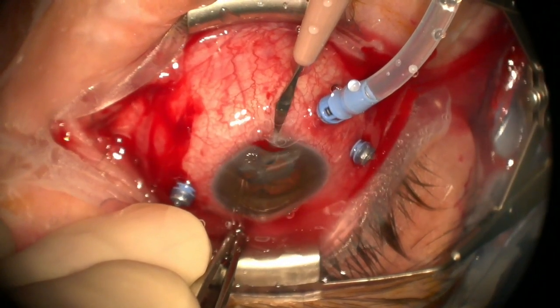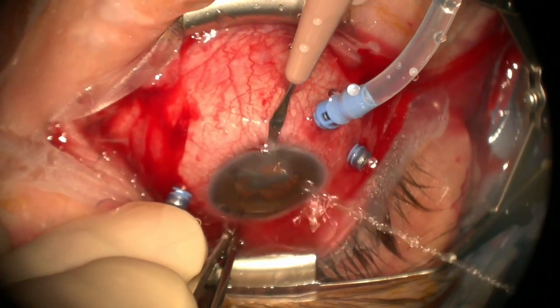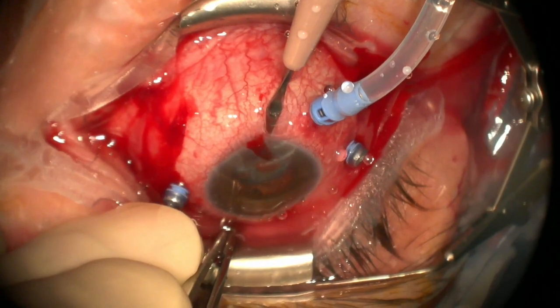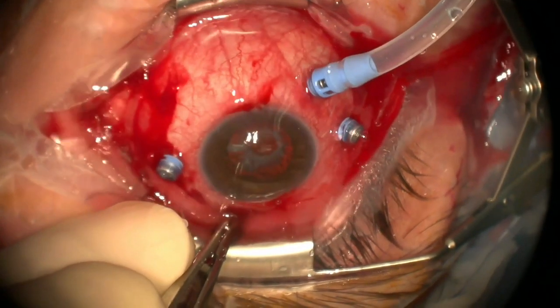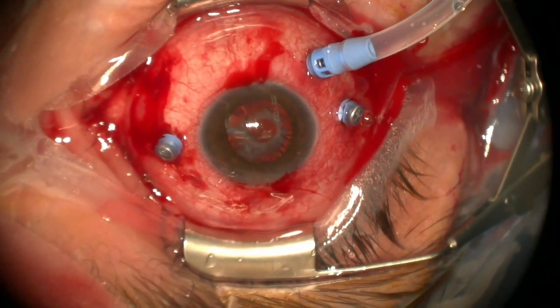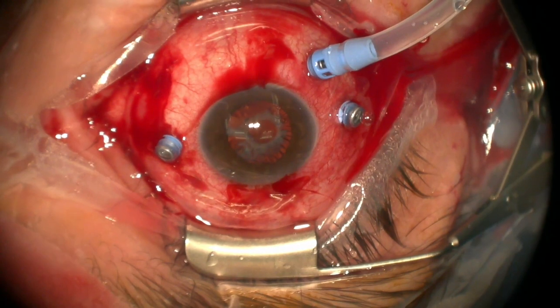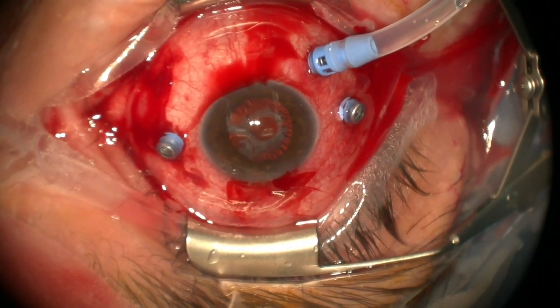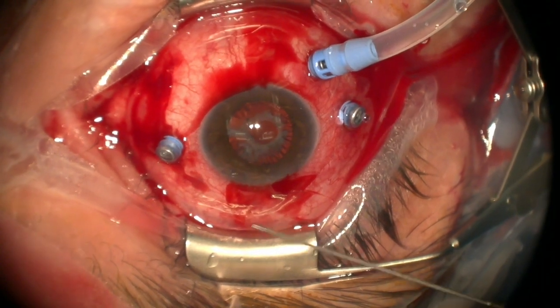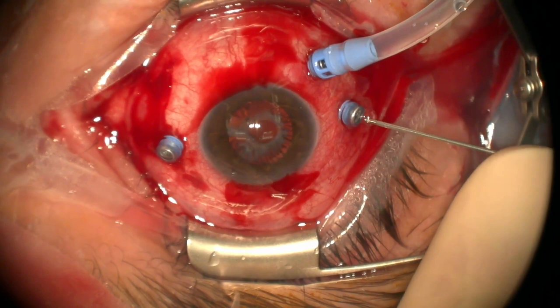You can see the oil still coming out there in the last of the bubble. And that's that. Okay, so the oil's out of the anterior chamber. Now we're gonna cut open the anterior capsule a little bit. This eye is certainly more, you know, the tissue is more friable, the eye's more inflamed.